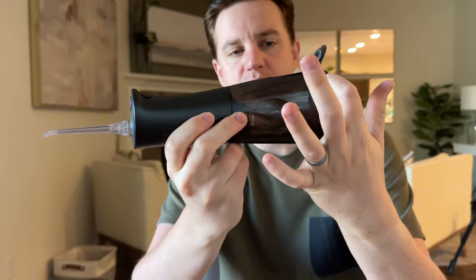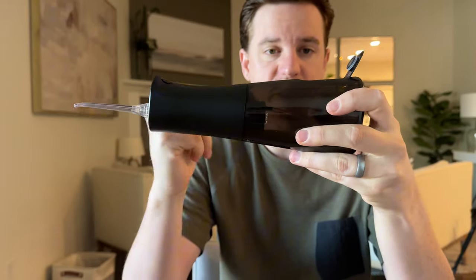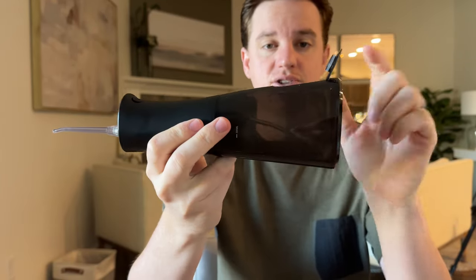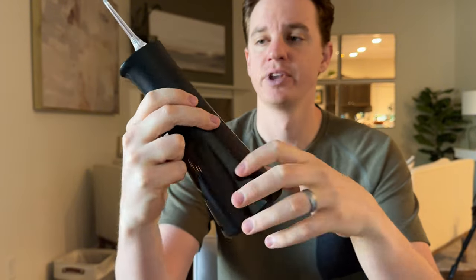They put the refill at a high point, which is really handy. If you've ever filled things like this up, you know it always leaks out. So having it at the high point, you can get it all the way full, which is really nice.